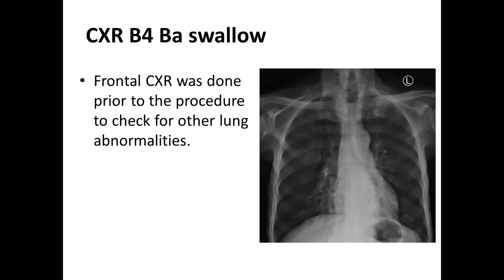The aim of this chest X-ray was to assess the chest, because there might be pathologies apart from the swallowing difficulties. We might proceed to do these contrast procedures, and maybe the patient's lungs have serious problems. So if there is aspiration, we use this one as a comparison to the chest that has aspiration.